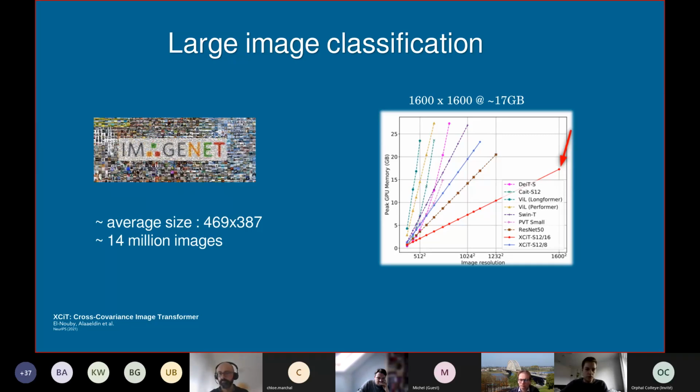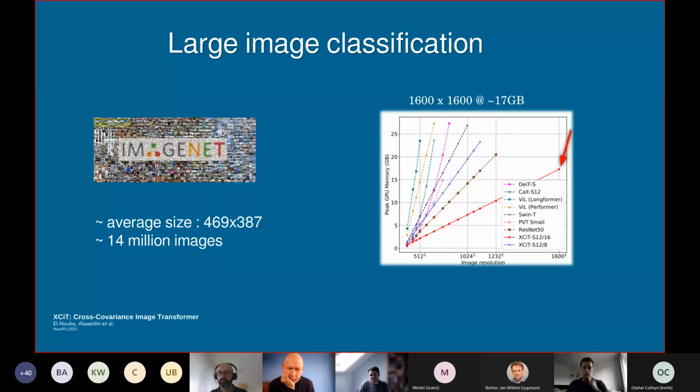And recently I've been reading up on the transformers, and there was an interesting graph where they try to also scale their trained models onto higher image resolutions. And they've shown that they were able to run inference on high definition image and video data up to 1600 here on the graph, 1600 pixels on either side, but well even into 8K. And so my question was then, is this really a relevant kind of architectural improvement when you're going to do something as whole slide image classification for medical imaging?